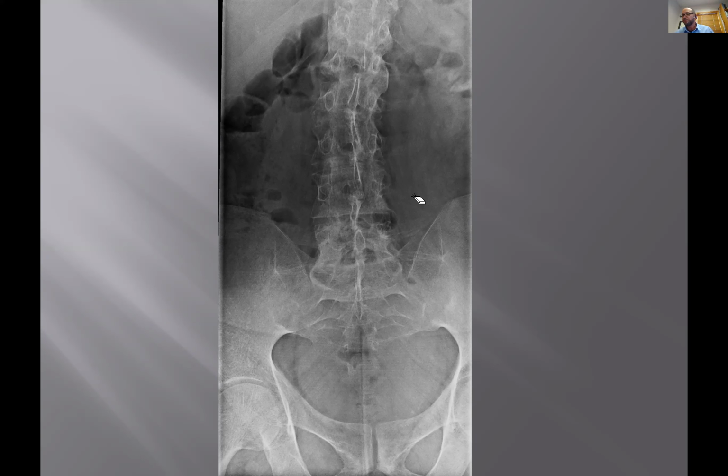All right. Let's, any questions on those 6 cases? And then I'm going to show you guys a couple more cases. We'll go to about 5 till. I get excited about this. I don't want to, but I got a couple more good cases. Any questions though before I show you one more case? Quick, what is the real difference between a marginal and a non-marginal syndesmophyte? I never did. Good question.